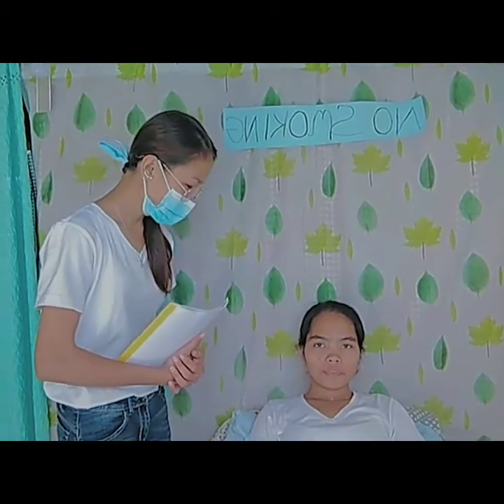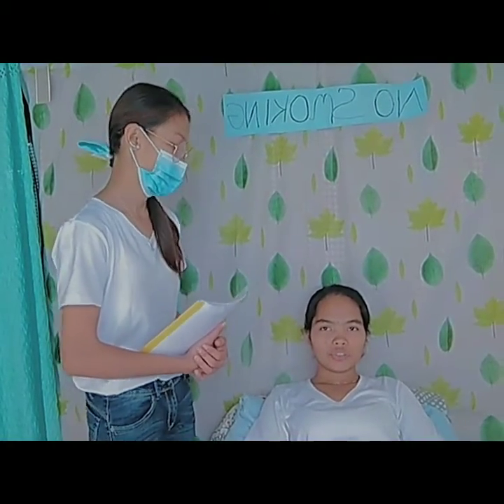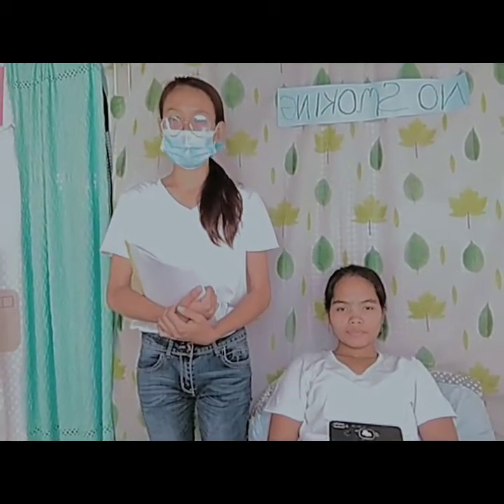Okay, Mom, what's your name? Junkie de la Linya. How about your age, Mom? 19 years old. Okay, Junkie de la Linya, 19 years old. The next is to provide your patient's privacy.